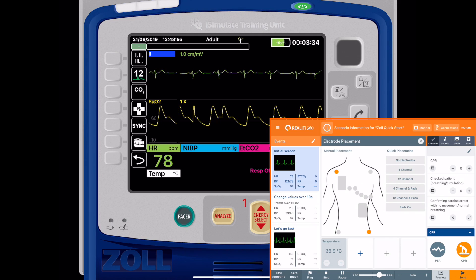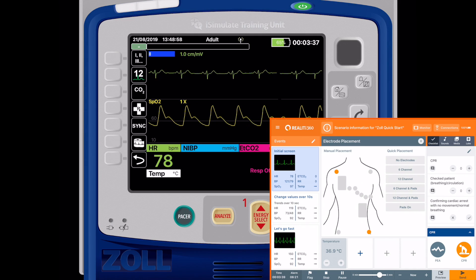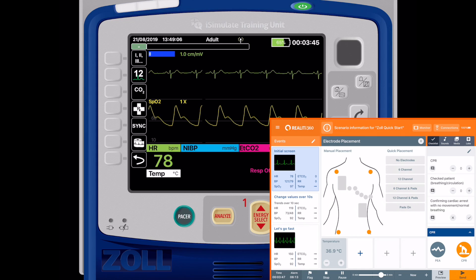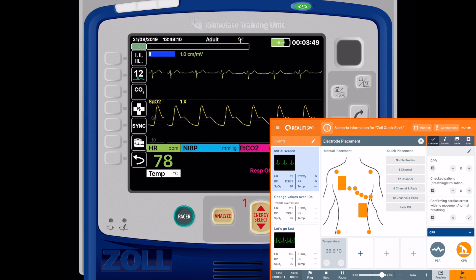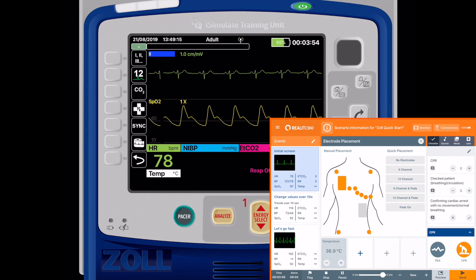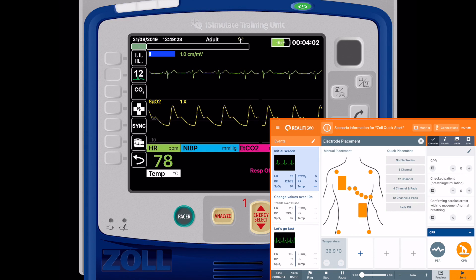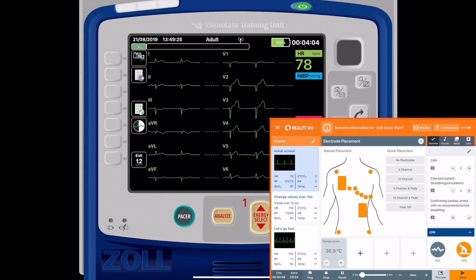As we add leads, you can add them by just tapping on the lead itself, or you can tap on the quick placement boxes — 6 channel, 12 channel — and then you can add the pads as well and toggle those on and off as you want. Let's look at what that looks like on the 12-lead display that the Zoll has, and you can see all of the leads are shown there.